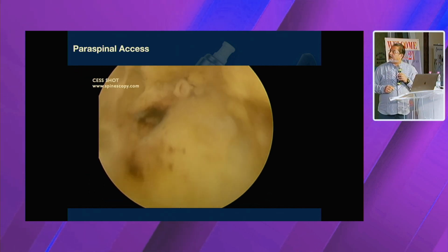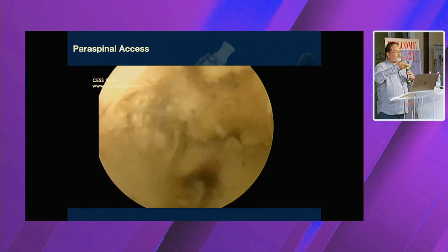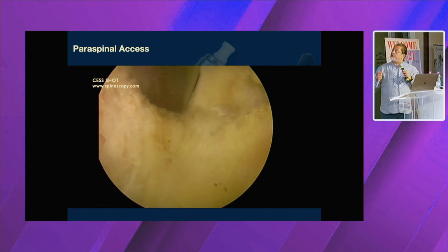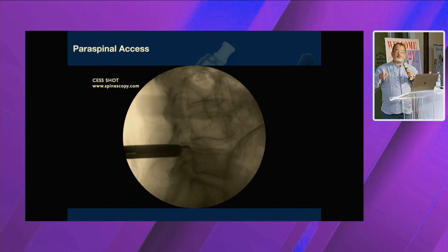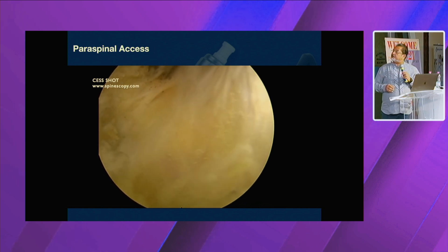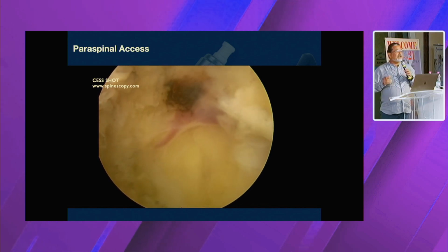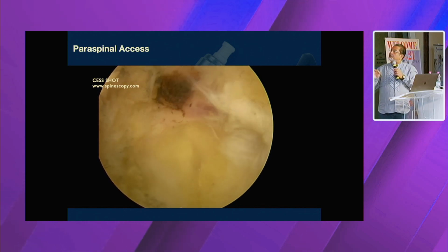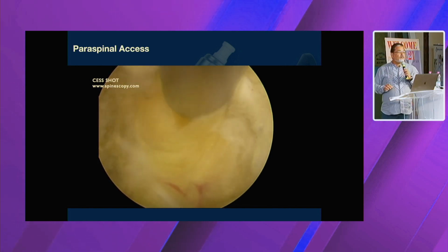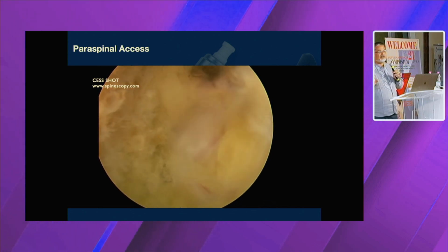Now, important thing is the ligamentum flavum, when it comes extraforaminally, attaches to the transverse process and continues as intertransverse ligament. Now this intertransverse ligament needs to be removed for you to gain access into the intertransverse plane. So you can see here, I'm removing the part of the attachment of the ligamentum flavum, or you may call it the intertransverse ligament, to gain access, and immediately underneath is going to be the fat. The moment you remove the fat, this is going to be the beginning of the vision of the exiting root, extraforaminally. Here you can see the exiting root, very, very clear.